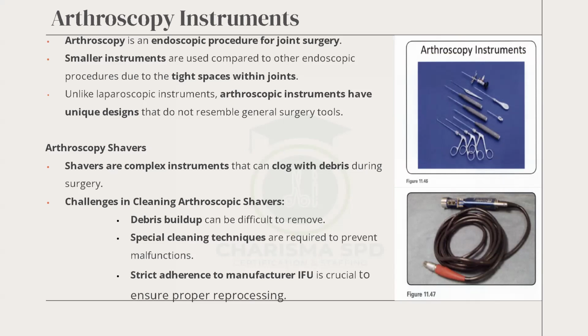That has a channel that needs to be brushed because debris stays there. The piece that is shaving is loaded over there, and then it comes out at the distal end, or the tip. And now getting to the silver end, go back to the picture. I just want to give them what they need to watch out for. Then we can go to the next slide.